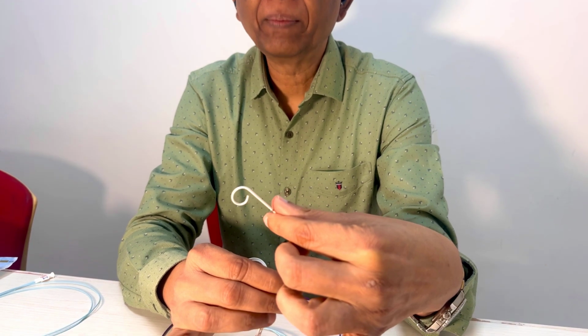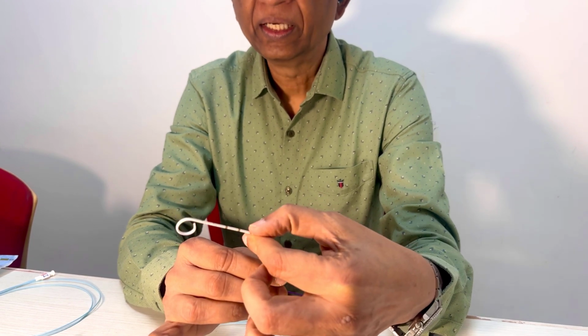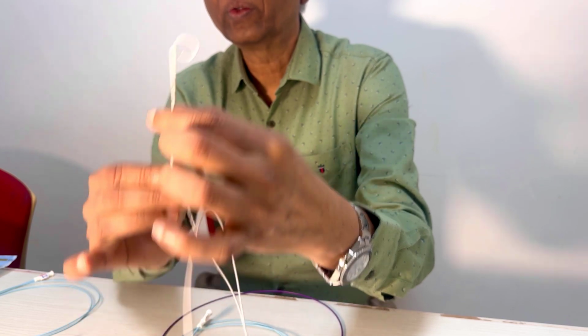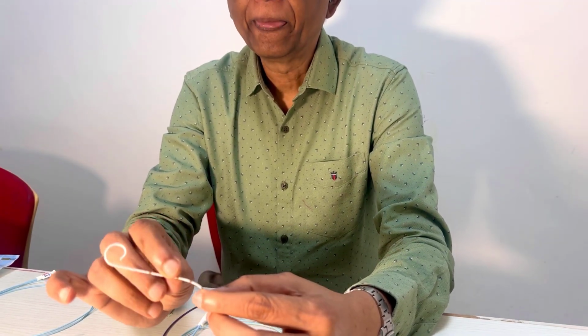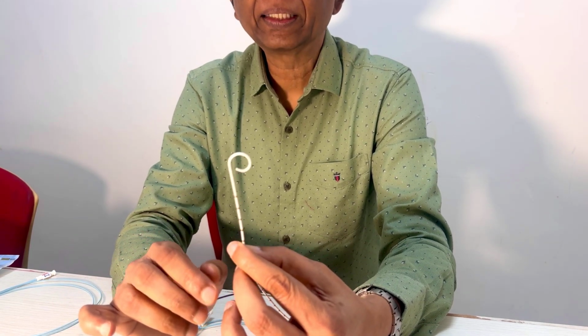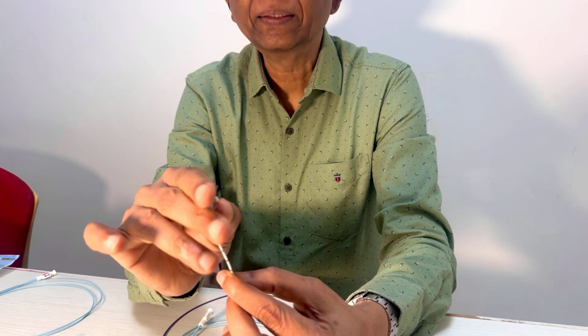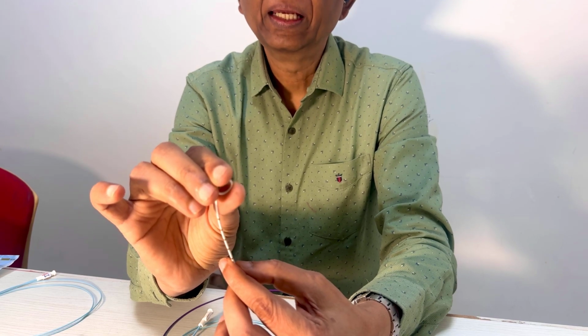Where do you use an angle pigtail catheter? For doing pulmonary angiograms. Because of the angle, when you go from the IVC, it easily enters the right atrium, and then when you turn it around, it looks up and you go up. Have you got that idea? So this is called an angle pigtail catheter, and a regular pigtail catheter, a marker pigtail catheter, and sometimes you can have a curve which is much, much tighter, which can give you a small pigtail at the tip.